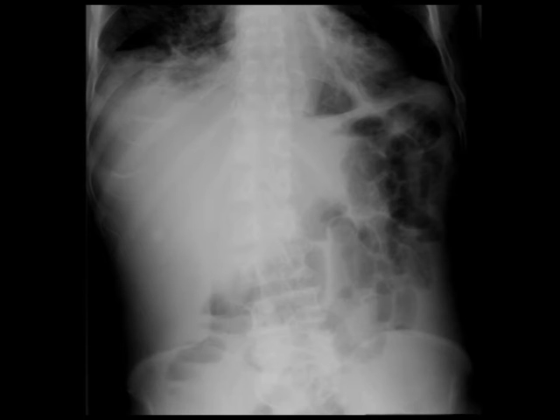This is a plain film of the abdomen, and you can see with the arrow there's a small round radio-density in the right upper quadrant.